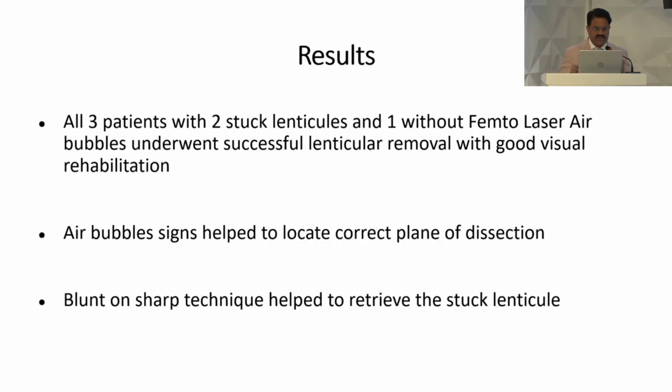All 3 patients, with 2 stuck lenticules and 1 without femtolaser air bubbles, underwent successful lenticule removal with good visual rehabilitation. Air bubble signs help to locate the correct plane of dissection. The blunt on sharp technique helps to retrieve the stuck lenticule.